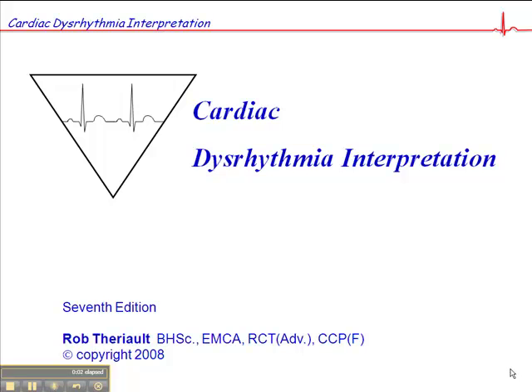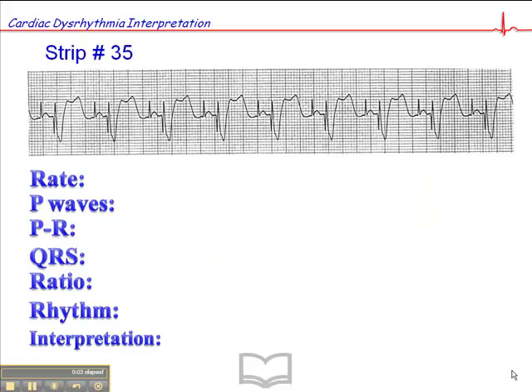We're on page 102, and this is exercise 35. In fairness, this is a rhythm we haven't really talked about. This is a pacemaker rhythm, and this is, in fact, a dual chamber pacemaker.